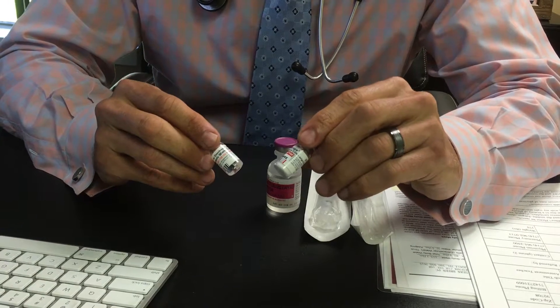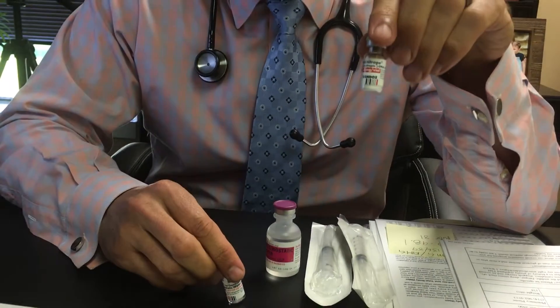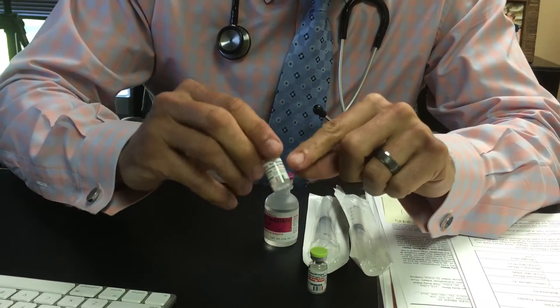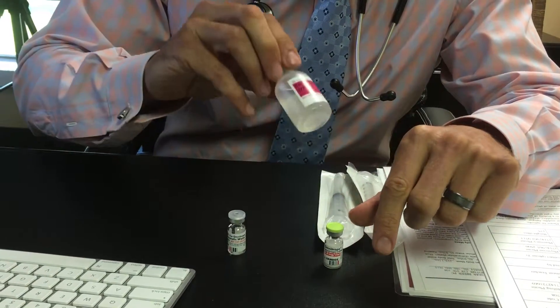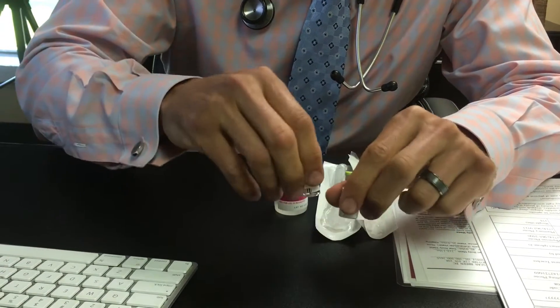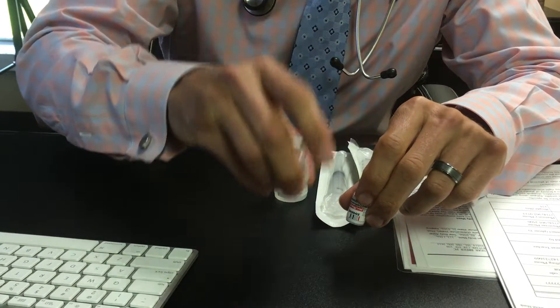When you get your Omnitrope, it's going to come with two things: a small vial that says Omnitrope with the powder in it, and a small vial filled with fluid — that's the diluent. You can discard the diluent because I'm going to have you mix it with the bacteriostatic water from the mixing kit. Keep the one with the powder; the small vial with the diluent you can throw in the garbage.